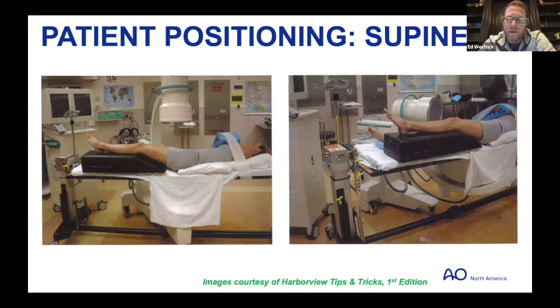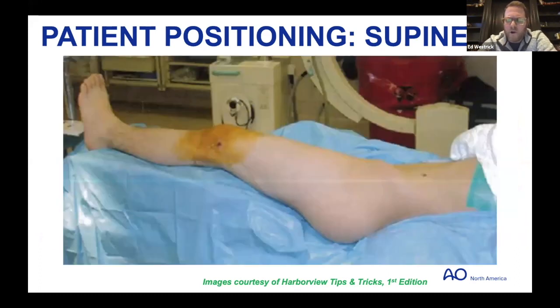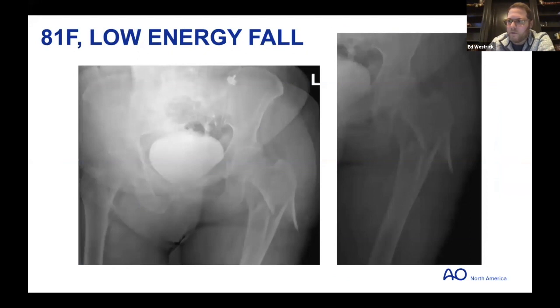So you can't see it there, but the contralateral extremity is well padded. The Foley is well padded. The other extremity is taped and positioned appropriately. And then as far as your drapes here, you can see this is the pre-drape, but you have access to the entire limb, buttock, flank. The start point is unencumbered, and there you can imagine your hand, as Jeff just said, the Beverly Hills butt cheek test or whatever he called it, that would pass. So this is a good setup for the next set of drapes. And we'll just talk about more detail as we go through some cases.